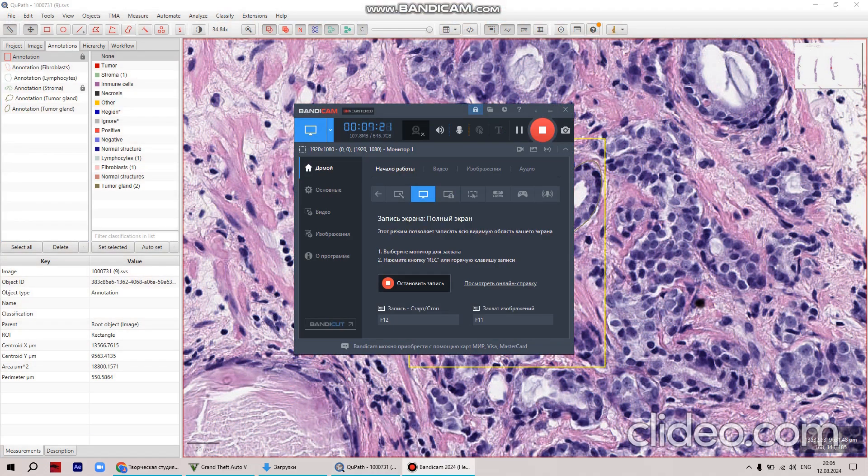Select the magic wand tool — you can draw with the magic wand, then hold Alt and use the brush to correct lines. Select the corrected lines and choose 'Tumor Gland.' Then select the brush or magic wand and draw stroma — for example, you create a stroma annotation.